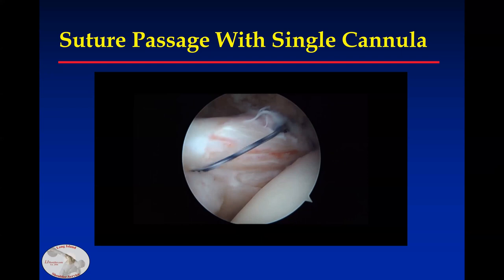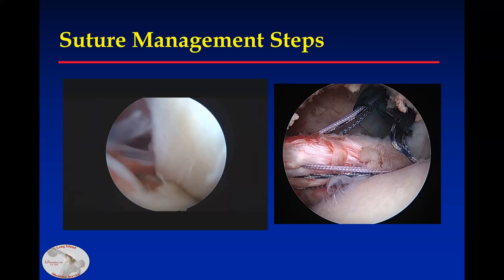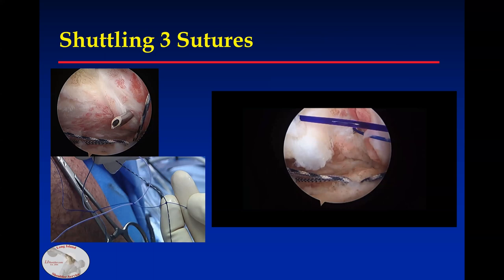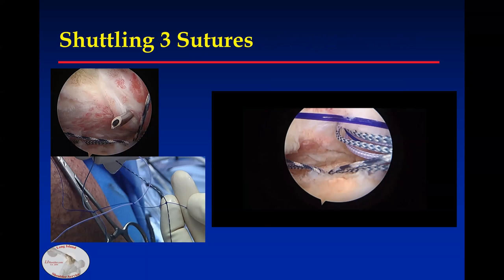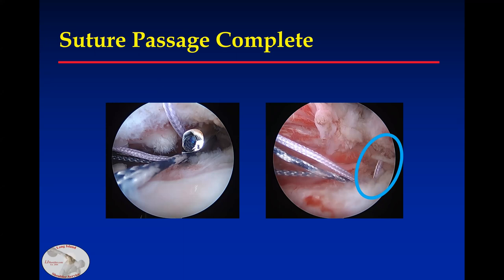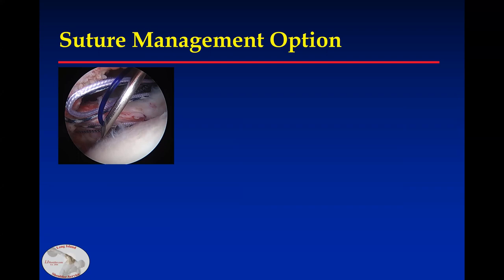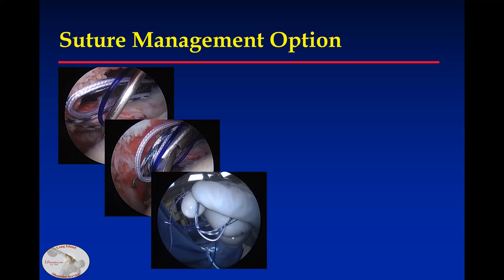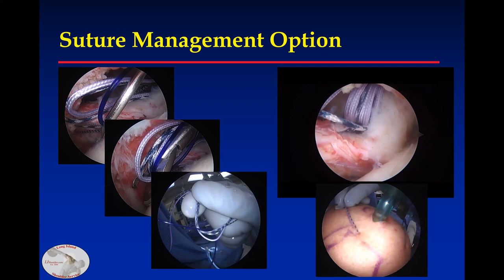Back to our case — now you've got three sutures passed, but you have some sutures above the subscapularis. I like to pass them through it, and I'll show you in another case. Pass all three together. You don't need to detach the tissue, and it's okay that they come through the same hole, because if there were a single anchor there, they'd be in the same position. For managing multiple suture pairs within the cannula, I'll bring a spinal needle with a loop of suture, retrieve the sutures I want to remove from the cannula out through it, place them into that loop, and bring it back out through the skin so I can tie one suture pair at a time.